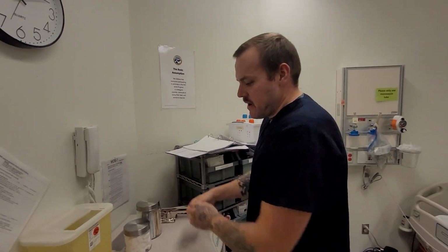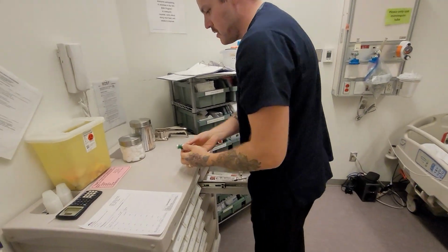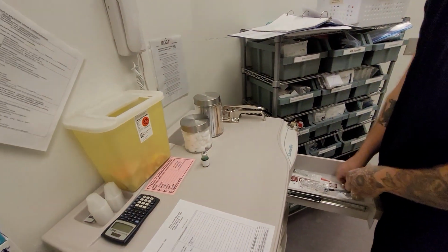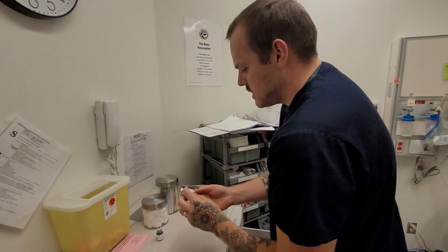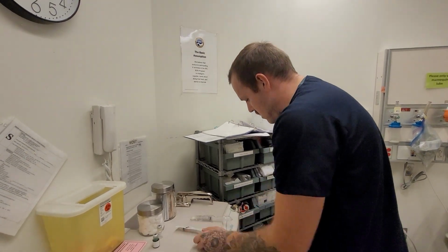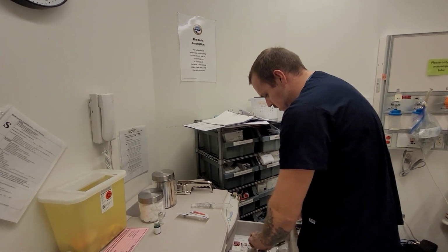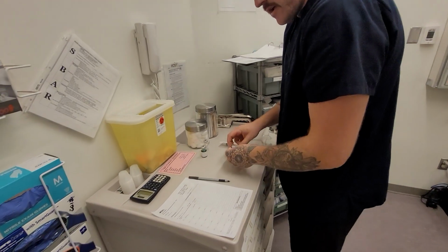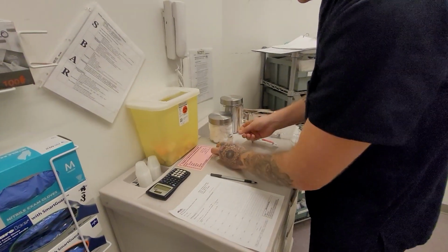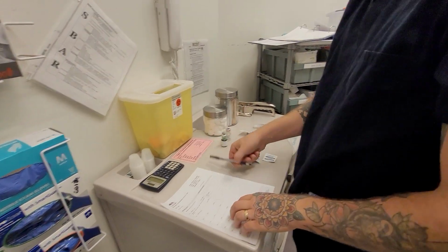So let's get our stuff ready. I'm going to give my hands a wash and we're going to get all our supplies out. So we've got our naloxone. Let's do our first check. Naloxone, not expired. Great. We've got our normal saline, not expired. We've got a flush, a 10 mil syringe, a blunt, some unopened alcohol swabs, and a pen. Look at that. Okay, so let's go ahead and clean the tops for 15 to 30 seconds. Going to leave that sit there.